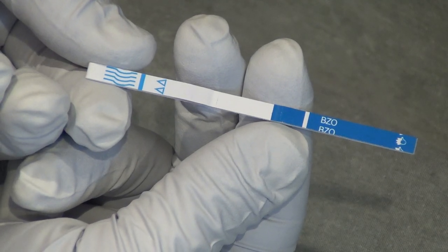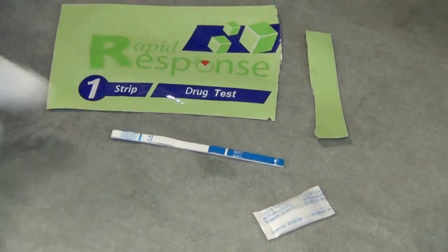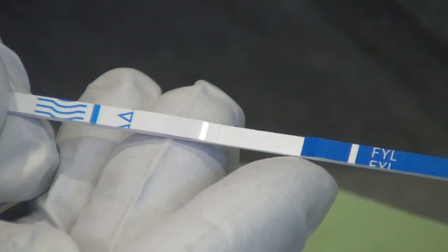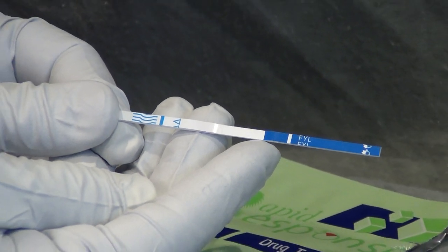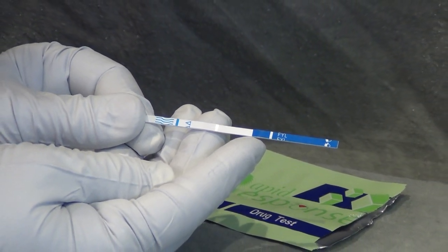One half is blue and helps confirm you have the correct testing strip by having a shorthand substance name such as FYL or BZO. The second half has blue squiggly lines indicating the part of the strip designed to come in contact with your fluid sample.